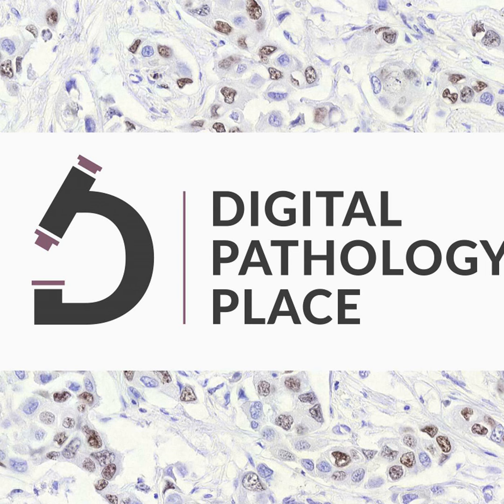The AI and three blinded dermatopathologists, that was for assessment, not for annotations. The three blinded dermatopathologists assessed the test set, and this is super cool, fantastic, they had immunohistochemistry serving as the reference standard, which is fantastic. Let's put a smiley here, because then you have an independent method and not just pathologists, right? But let's see what happened.